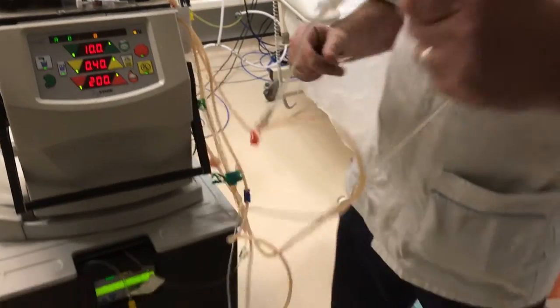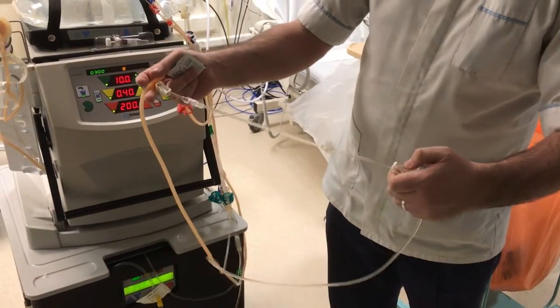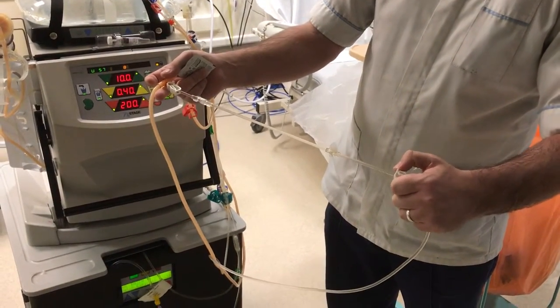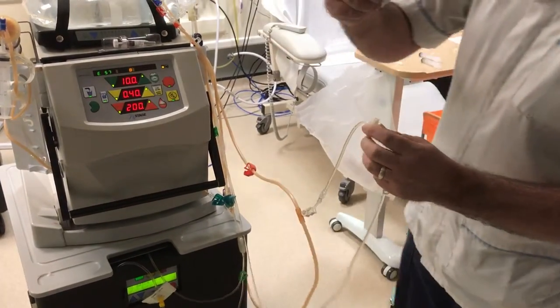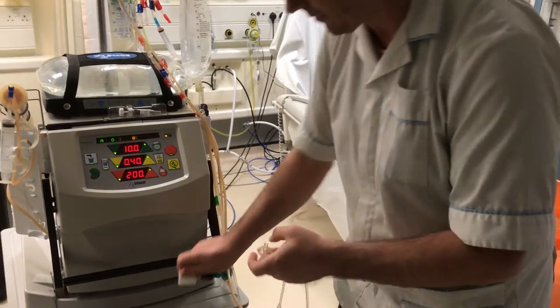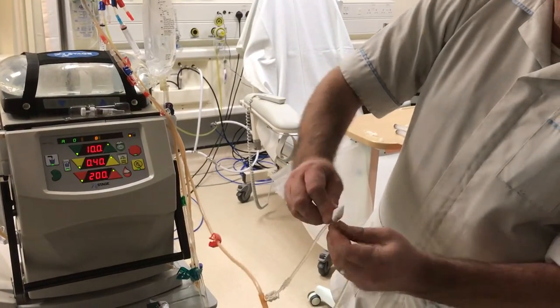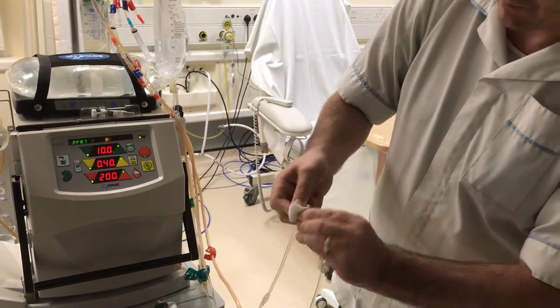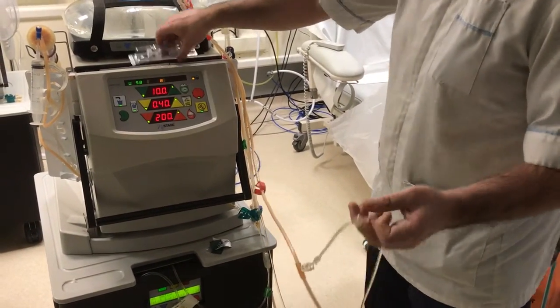We need to get our white line with our saline T attached and open the white clamp above the white line. We take the cover off — this needs to be placed on your pack somewhere clean, as it's going to go back on the machine. We're going to use the wipe and wipe the connection.